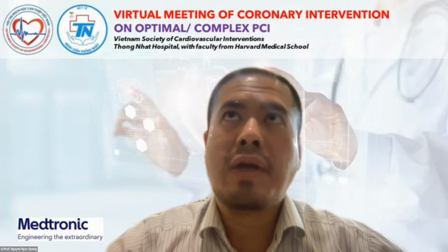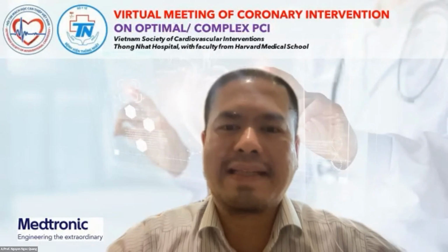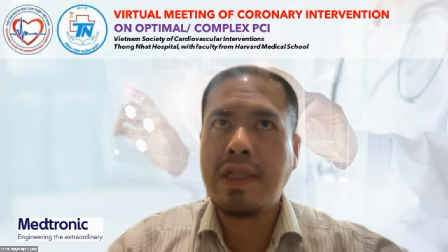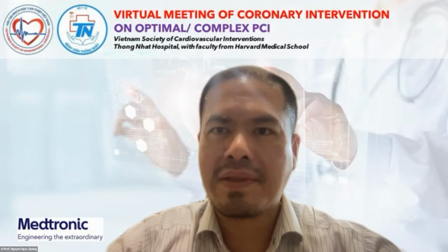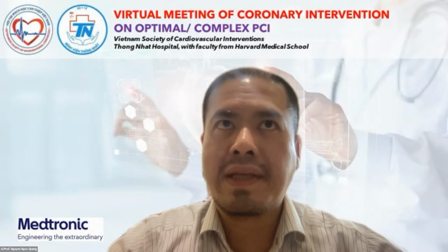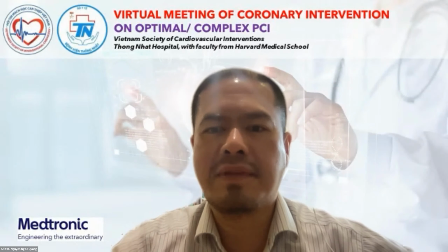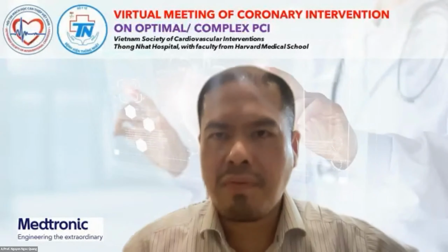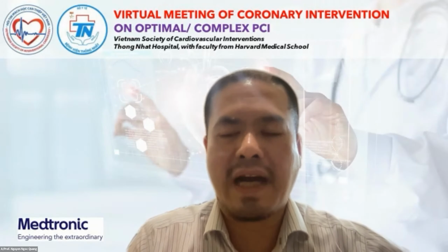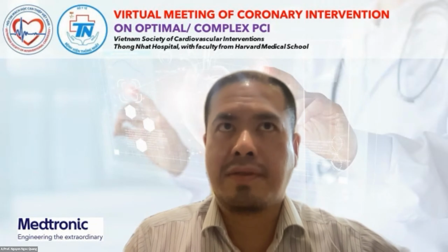Long ago, when we did PCI, we usually followed the principle that bigger is better. Sometimes we post-dilated too much, and then we saw the flow got a problem. So at that time, we thought there is an interaction between the flow and the diameter of the vessel. And now Professor Thạch gives a new example about the benefit of IVL, where we can increase the size of the vessel.